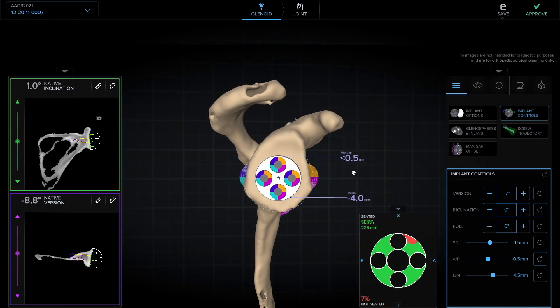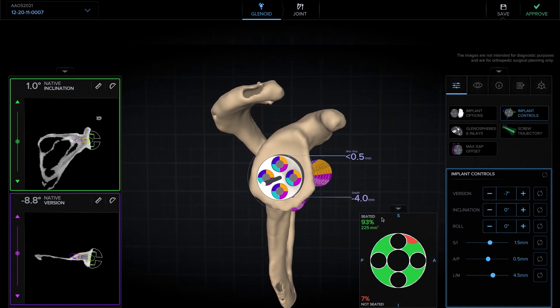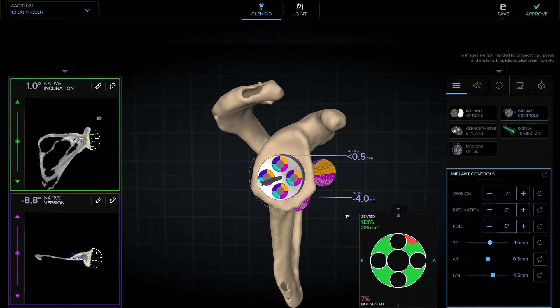This depth of reaming — this 3 to 4 millimeters of reaming that we'd be doing in this case — will then be transferred to the final VIP plan provided to you as a surgeon with a letter that you can then transfer onto your pilot reamer so that you match the depth of reaming in your VIP plan with what you achieve intraoperatively.